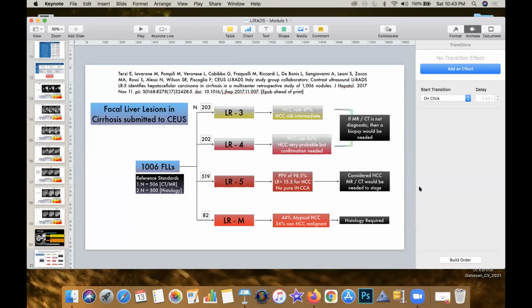Okay, so it's pretty much easy. A hemangioma typically would show, depending on the types of course, but we generally just label them as hemangiomas. If you take a standard hemangioma, there are four basic features: peripheral, discontinuous nodular puddles of enhancement on the arterial phase.